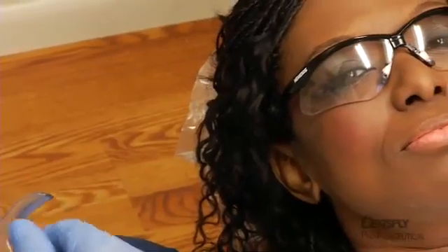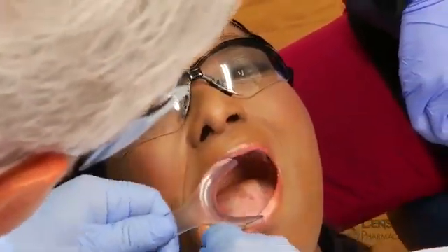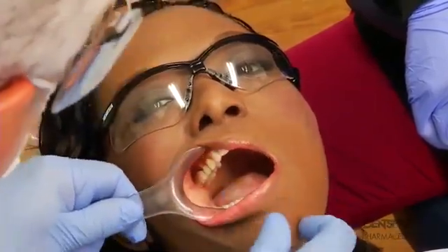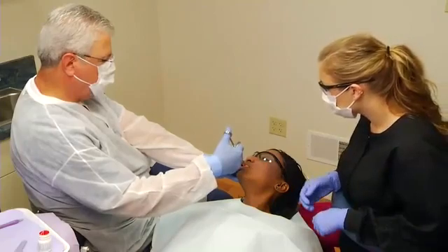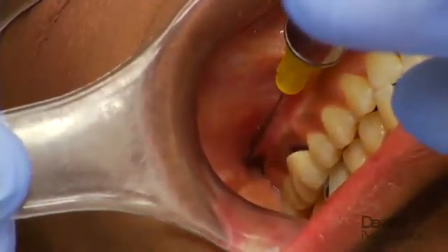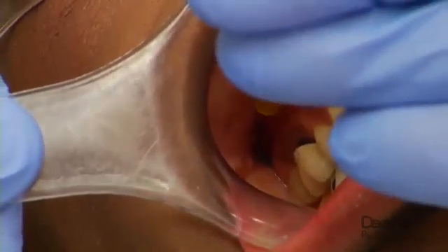With the patient's head adjusted to facilitate visualization of the retromolar region, the cheek is retracted with the thumb to expose the insertion point midway between the ramus and the maxilla at the height of the mucogingival junction of the maxillary molars. With the syringe parallel to the occlusal plane, the needle is inserted posteriorly through the mucosa and buccinator muscle to enter the pterygomandibular space.